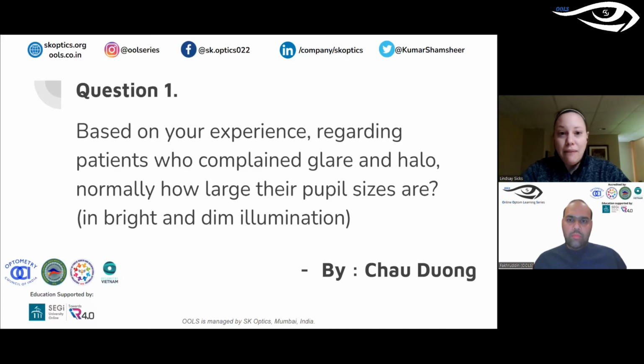So we have a Medmont. I think that's a fairly popular model. Not to say that you need that one to do orthokeratology, but it has some elements in it where you can dig into the file and get things like sagittal height. You can get that out of other topographers, certainly.